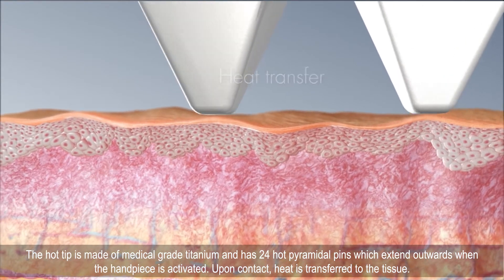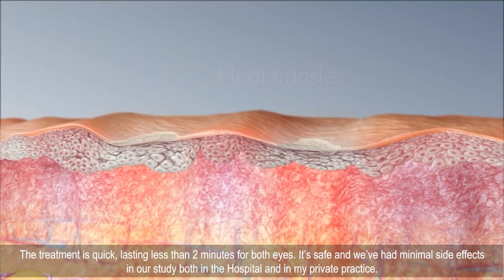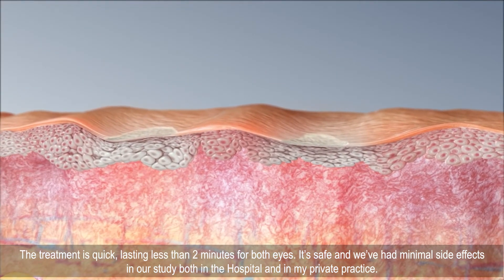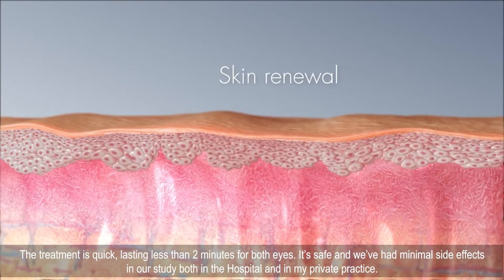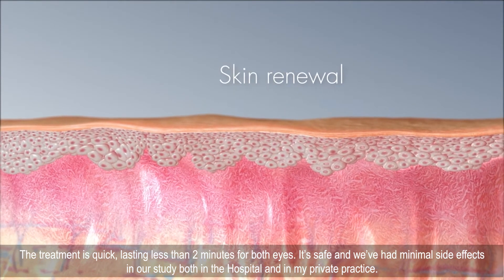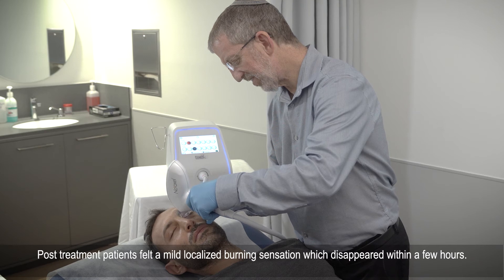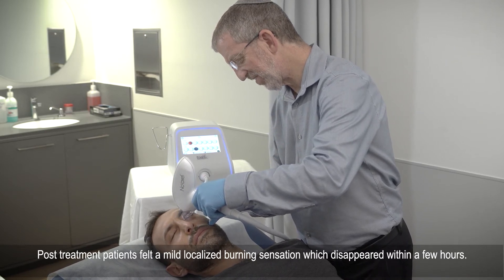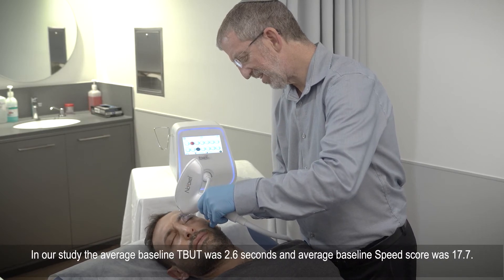Upon contact, heat is transferred to the tissue. The treatment is quick, lasting less than two minutes for both eyes. It's safe and we've had minimal side effects in our study both in the hospital and in my private practice. We use low energy settings so there's no need for topical anesthesia. Post-treatment, patients felt a mild localized burning sensation which disappeared within a few hours.